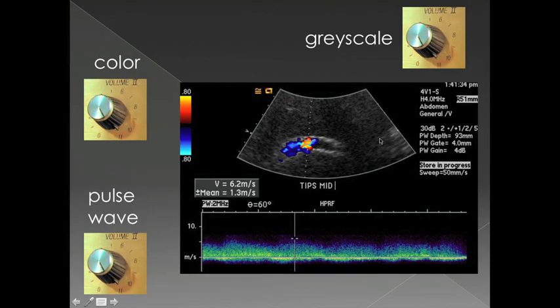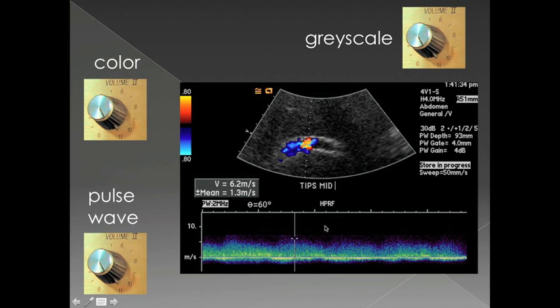When you add the complexity of pulse wave or spectral Doppler, you add another additional gain. For this particular image you can see the grayscale image with color Doppler overlaid, and down here you have the spectral waveform tracing. Each one of these different portions of the image comes with its own volume knob. The gain is set pretty well here — you don't see very much background noise, it's nice and black, and you can see the spectral waveform clearly.